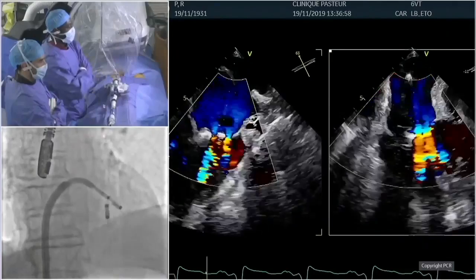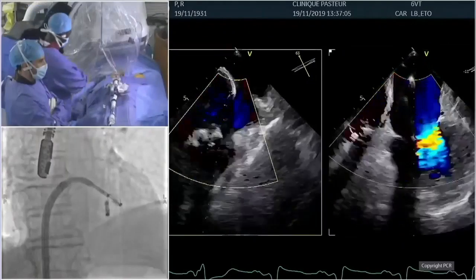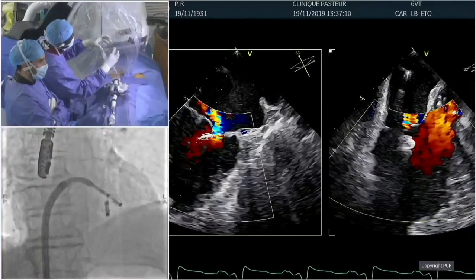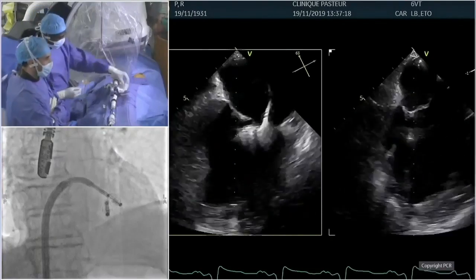Yeah. I think we saw an example of that too with the folding that happened with the first grasp, is that sometimes the leaflet goes in, folds rather than gets down into the apex. So the team did a very, very nice job getting into the apex. Should we go back to Toulouse, I think? So. Great, thanks Philippe. Gigi, Nicolas, can you hear us again? Yeah.